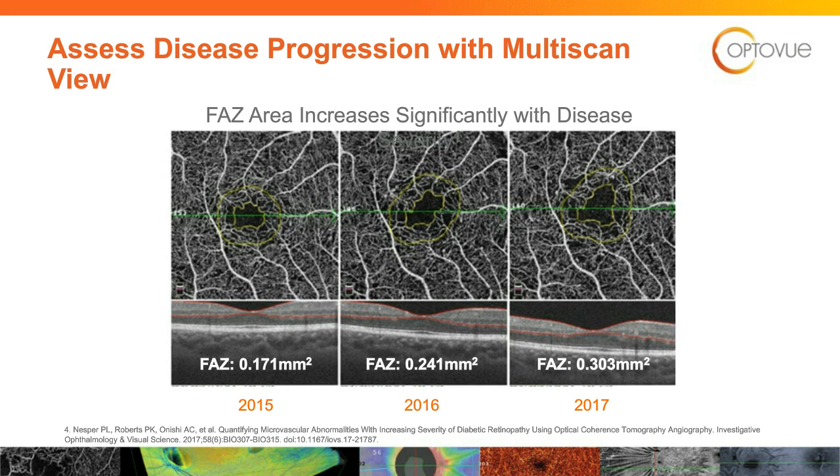Maybe you don't do it every year, but you're diabetic, so do a baseline scan. I understand you may not be able to bill for that, and we've talked about the billing, but to be able to get a baseline OCT angiogram, maybe you don't do it next year or the year after, because you got your baseline, vision's good, back of the eye looks good, their A1C's 5.8. Maybe you don't do it for year 2, 3, 4, but you got it for the baseline. So I'm especially recommending a baseline, and I'm even starting to consider, if you're doing an OCT, do an OCT angiography, and I might even be leaning for an OCT angiography even before that as well.